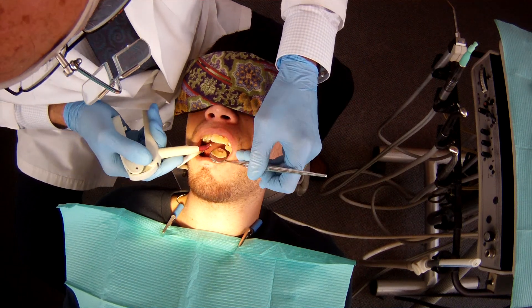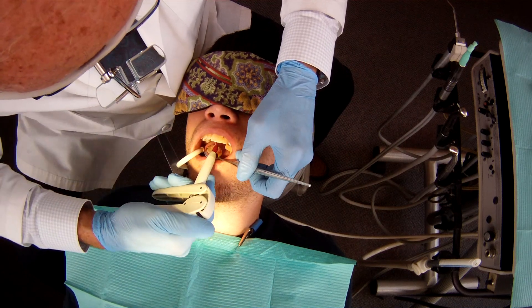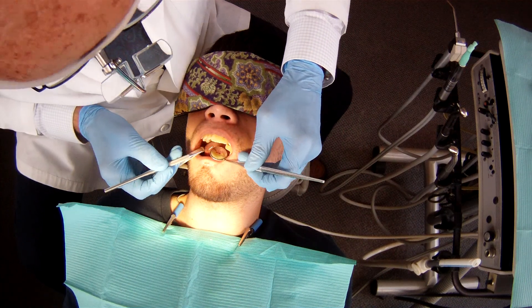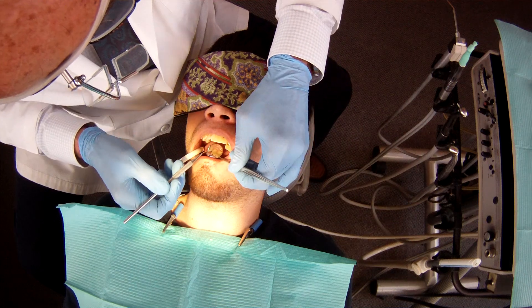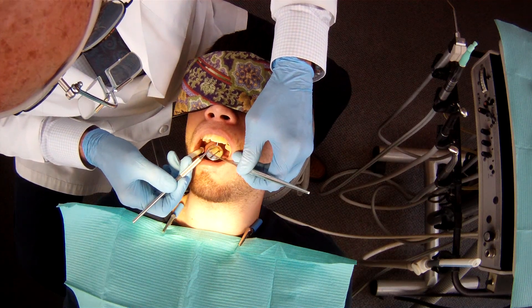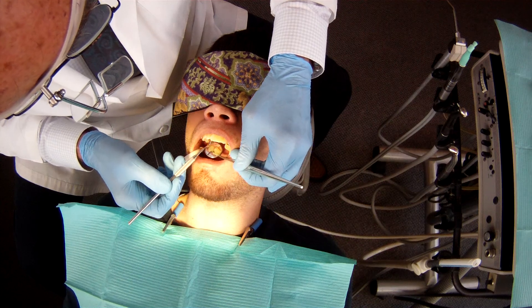And then we'll be adding material to the tongue side, or what we call the lingual. This is the augmentation of the wings of the wing pontic. The wing pontic has its own wings, but then we build on top of those the composite so that it layers out and forms greater wings of attachment.